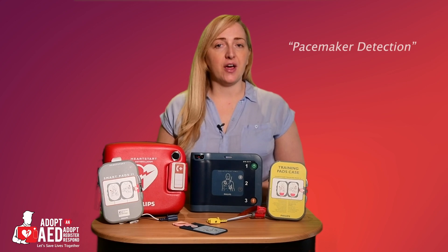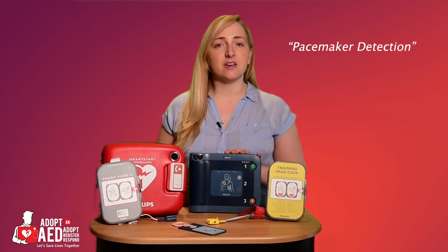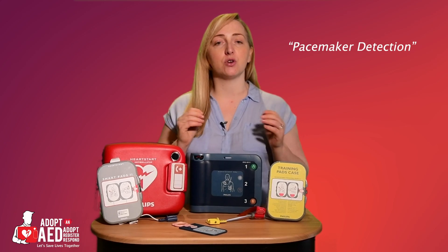A nice feature of the FRX is the pacemaker detection. The FRX can detect pacemakers within patients and differentiates between the pacemaker rhythm and the heart's actual rhythm, analysing if a shock is required.